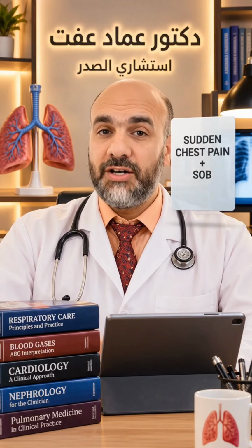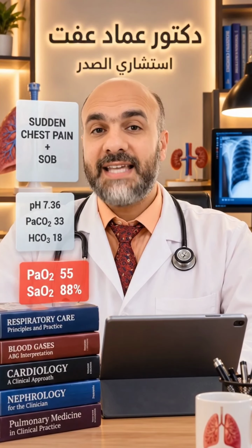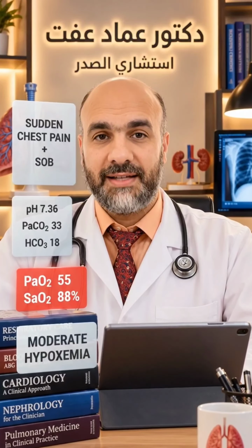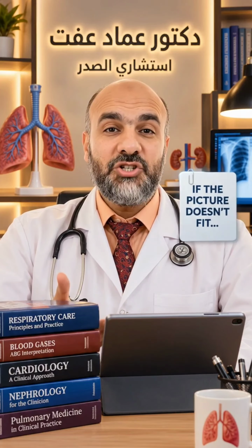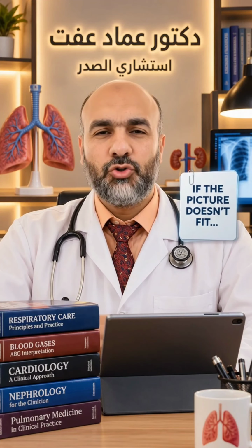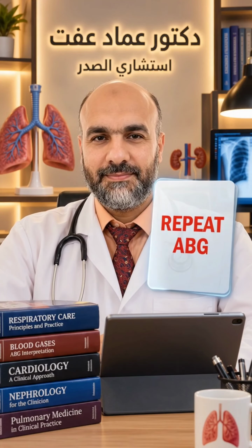The pH is near normal, but PaO2 is 55, and SaO2 is 88%. That's hypoxemia. If the ABG doesn't fit the clinical picture, don't force the diagnosis. Repeat the ABG.